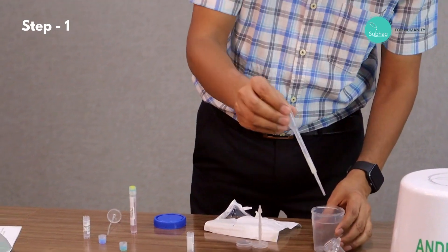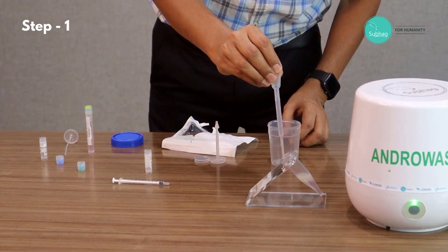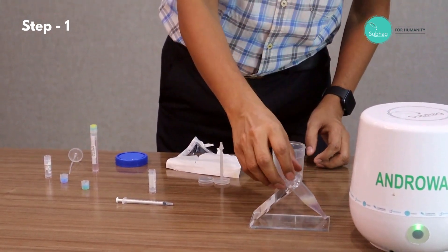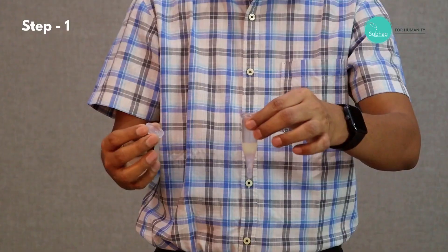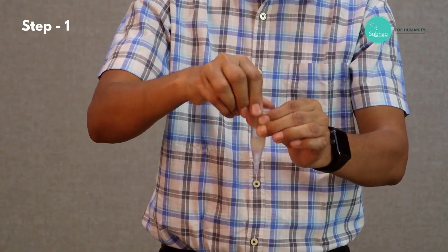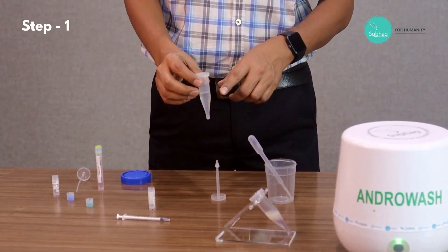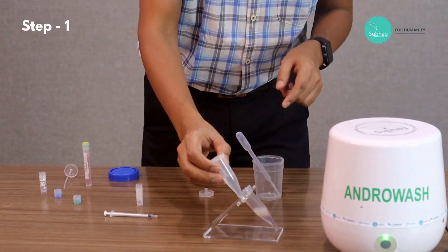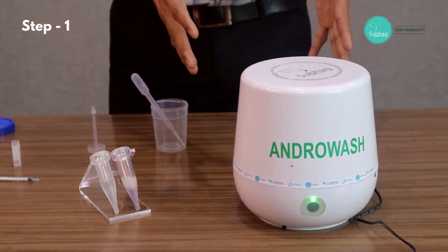Then we take the remaining quantity. As you can see, the layering is done. We put it on the preparation stand. Now we take the balancer tube — as this is a one wash at a time process, we need a balancer tube — so we take water to the same level so that it is balanced. Now the preparation is done and it is ready to load into the machine.